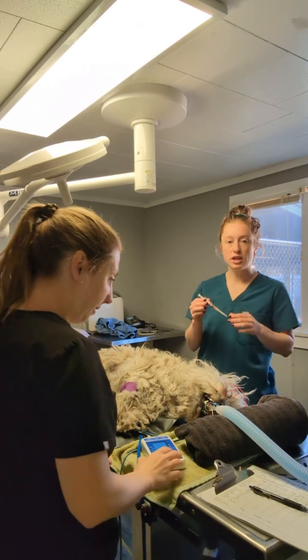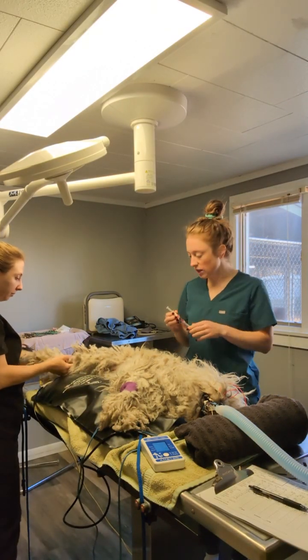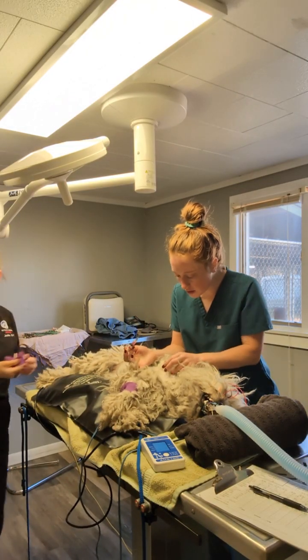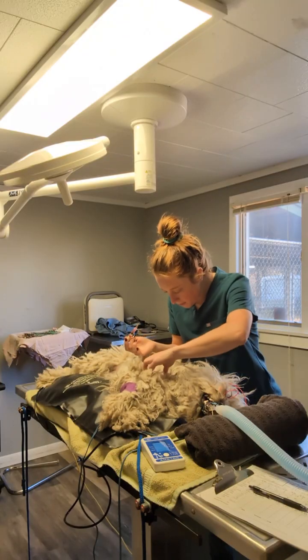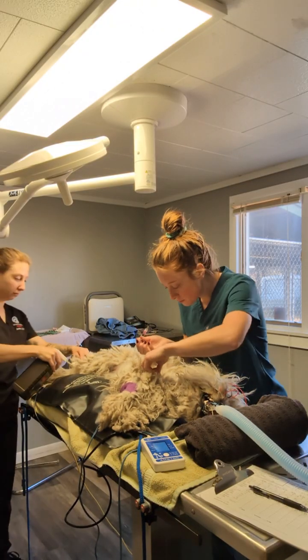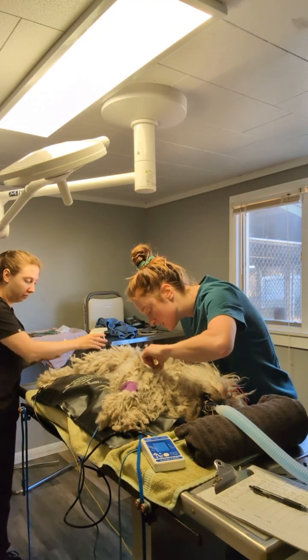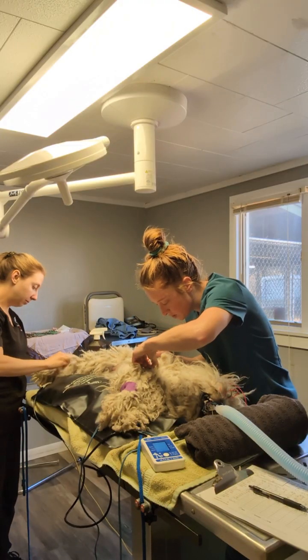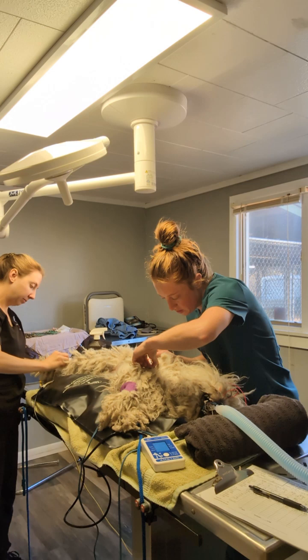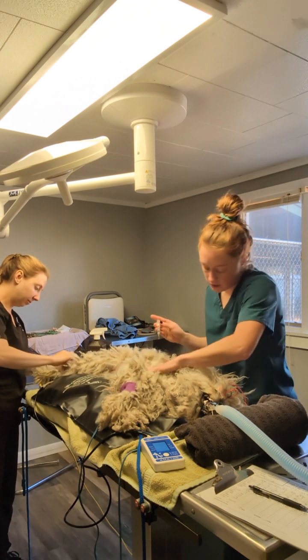Okay, so I'm just going to give her vaccines. She has some vaccines due, so I'm going to give those subcutaneously. So rabies, we're going to do in her right shoulder. Make a tent out of the skin, poke into the center of the tent, pull back to make sure that there isn't any blood flash, and then plunge the vaccine.